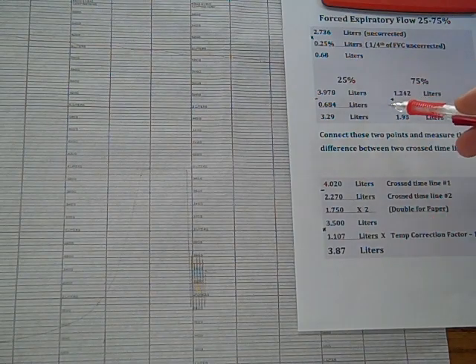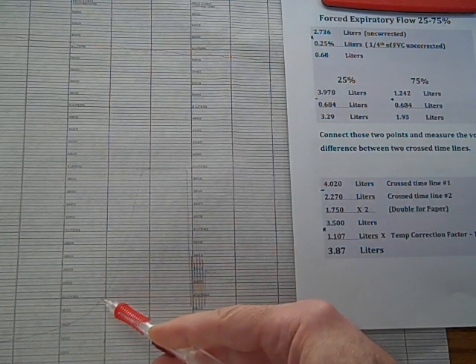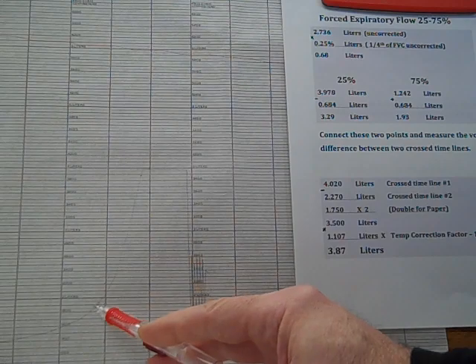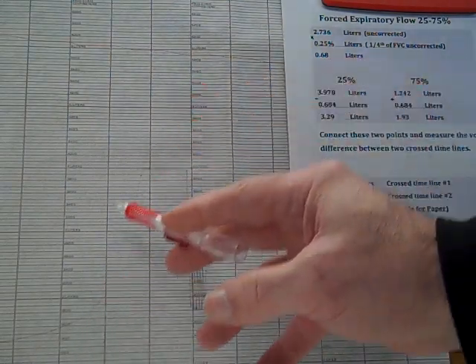And then we'll find where it is 75%, where we're going to go up from the bottom to about 1.93 liters, and we put a point there at 1.93 liters, and we'll take a line and connect the two until it overlaps one of the second lines.